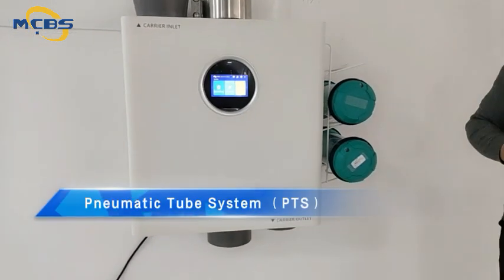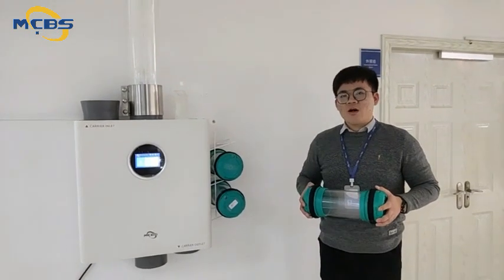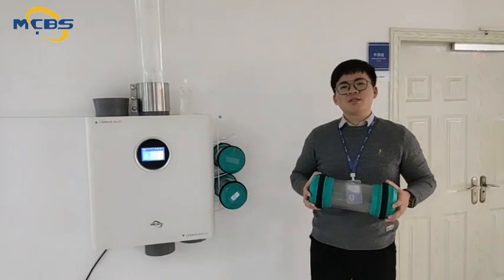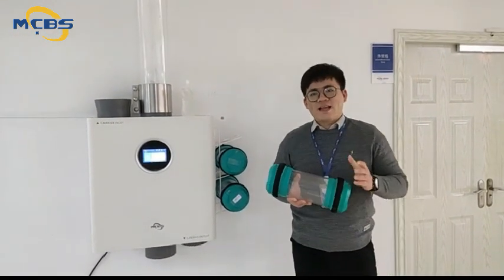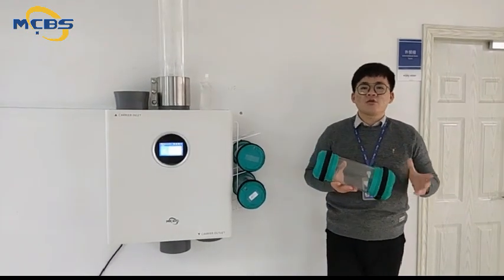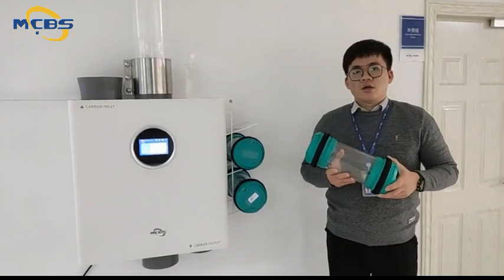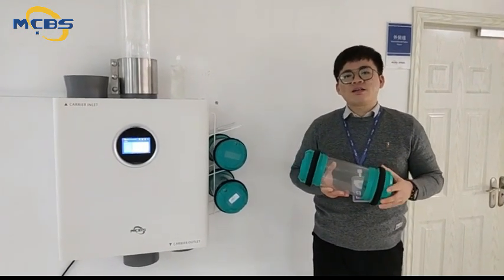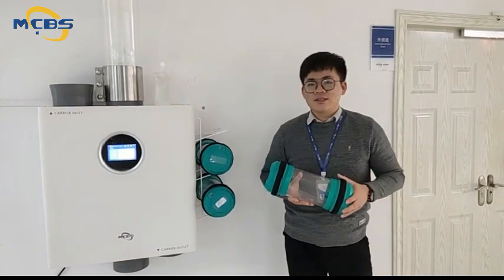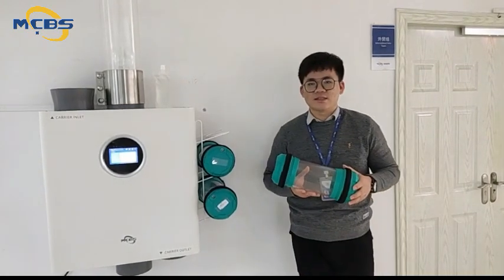Recently, we have upgraded our showroom, so now I can't wait to share these new systems with you. Pneumatic tube systems work with a cylindrical container called carrier, propelled through networks of tube lines by compressed air or vacuum to transport small materials safely and efficiently to its designated stations.